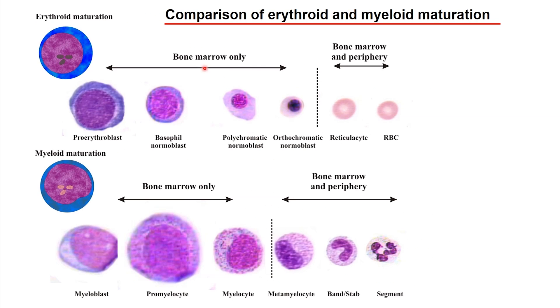Looking at the two most important cell populations in the bone marrow — the erythroid in the upper panel and the myeloid in the lower panel — they are not the same and they do have some very striking differences. The erythroid cells do have a round nucleus, while the myeloid cells do not have a round nucleus. Another very important difference is the color of the cytoplasm: the erythroid has a very basophilic cytoplasm, while the myeloid cell line is less basophilic, or less blue.